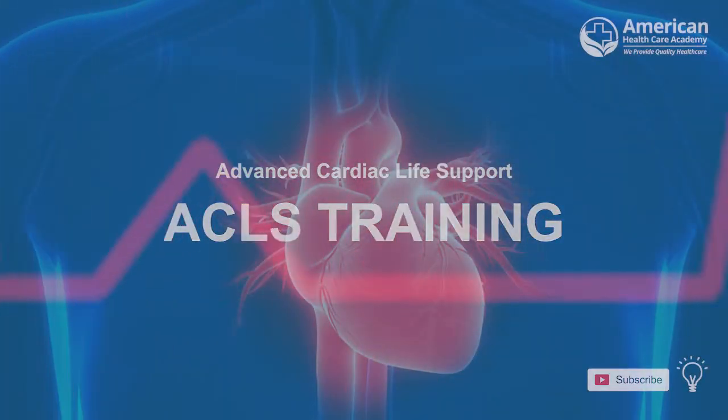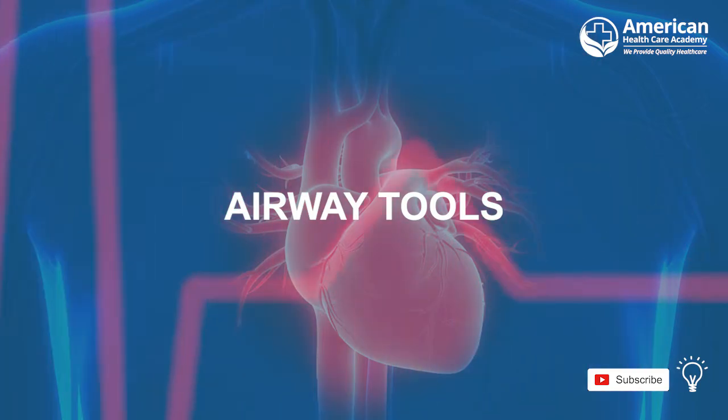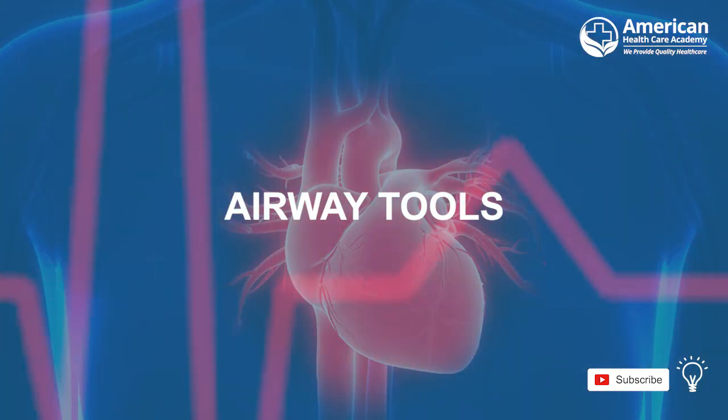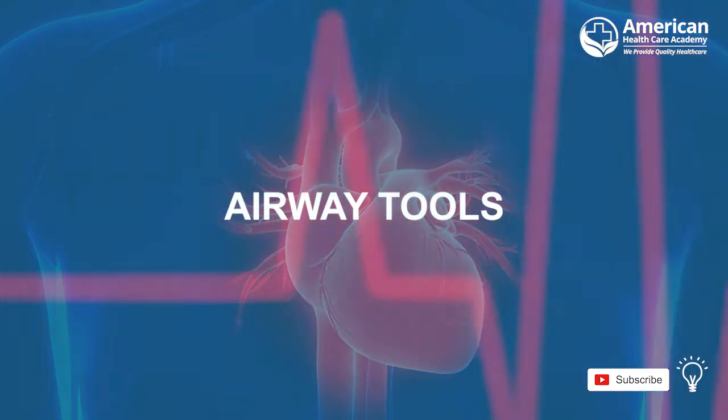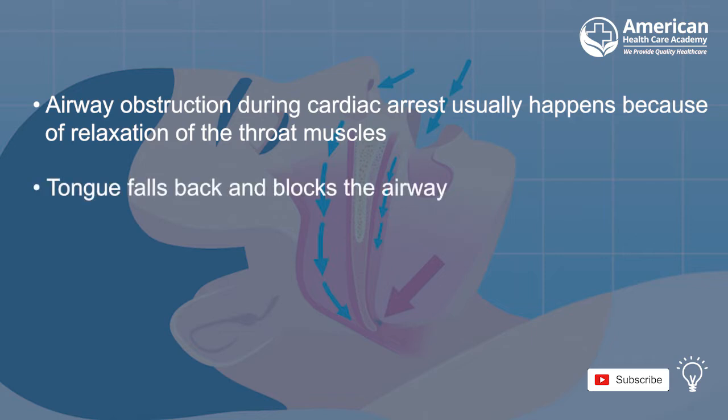Welcome to the Advanced Cardiac Life chapter on airway tools. It is imperative you know what the basic airway tools are and how to open the airways for ventilation. Obstruction of the airway during cardiac arrest usually happens because of the relaxation of muscles in the throat, which causes the tongue to fall back and block the airway.